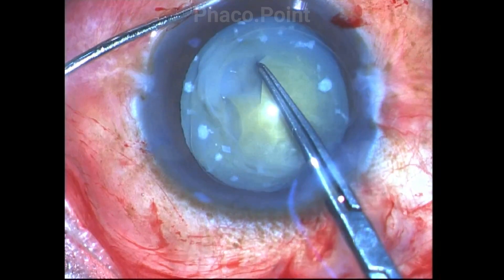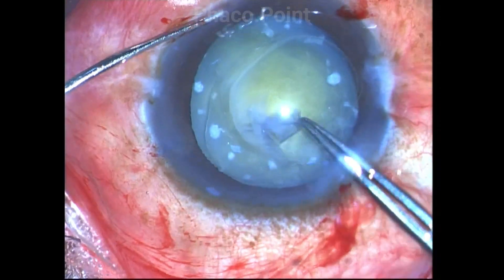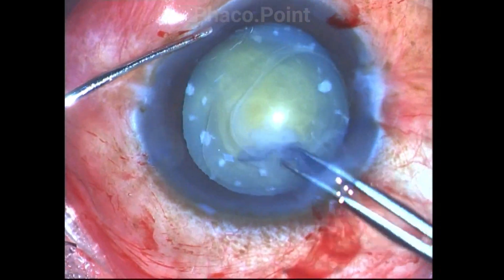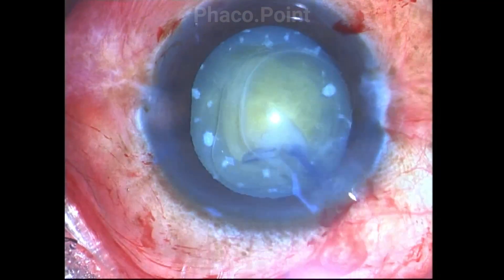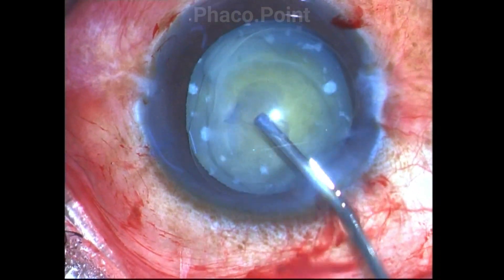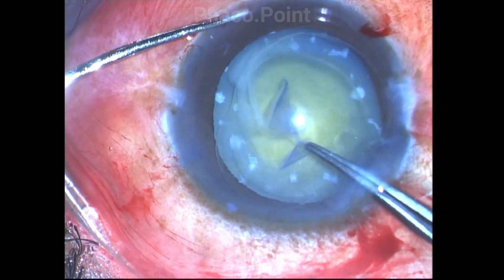The capsulorexis should be done very carefully, taking into account the small calcific spots and the fibrotic areas in the anterior capsule. You see that in this case, I am insufflating the anterior chamber repeatedly many times with viscoelastic before I can successfully complete the capsulorexis.